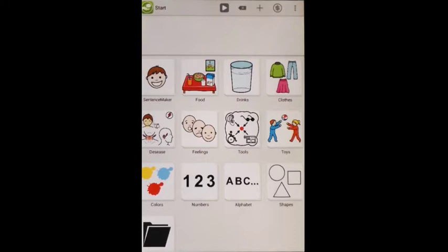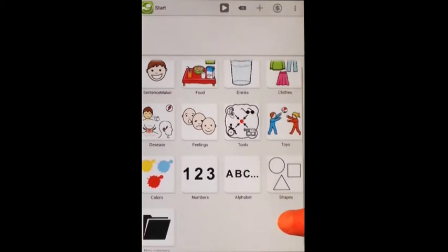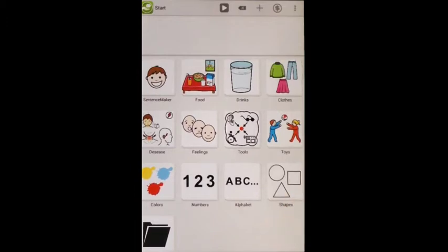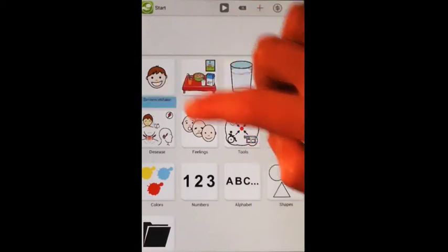So, I'm going to walk you through the app here, and you see I've got a new setup since we were having lag issues with the streaming. This is the beginning of LetMeTalk. This is what it looks like. We've got these different categories. All of these are pre-made. They come with the app. So I can just click into one of them.